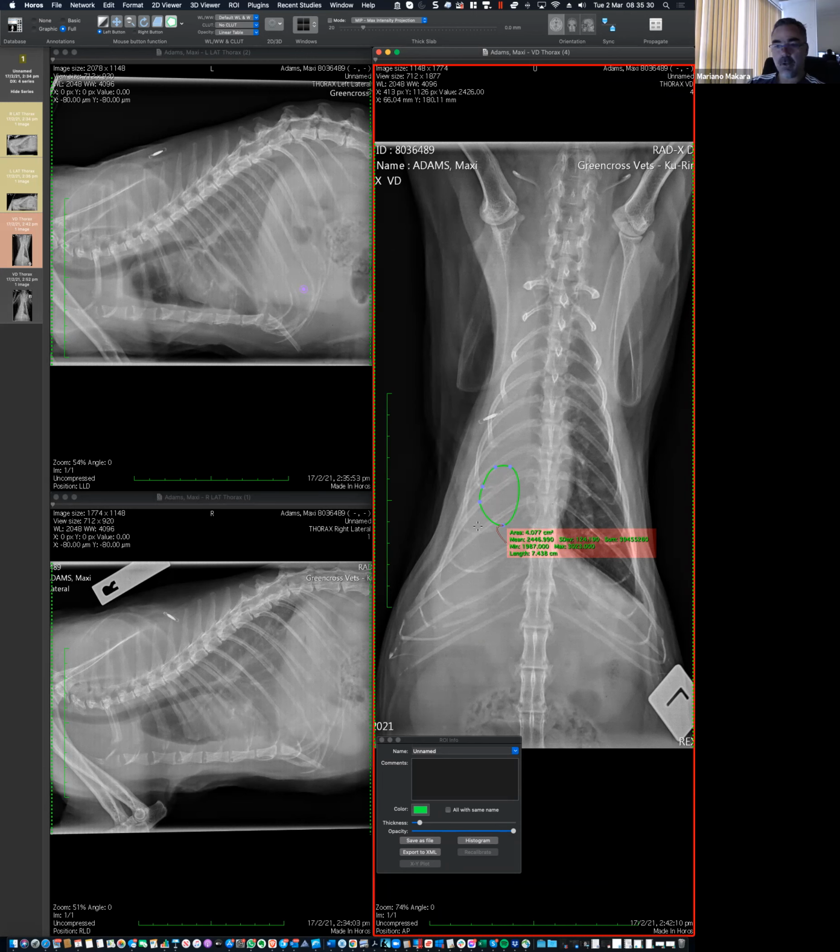And I don't have any argument against that idea. That idea is a very good idea. And then that idea could also explain, depending on where you locate that mass, the distribution of the changes. Makes sense? Because your theory needs that mass to be able to bleed in the airway. Makes sense? So if you put that mass in the airway and you put it high enough in the bronchial tree, then it can easily affect one side of the lung. Makes sense? All the right lobes and not the left lobes. Is that okay?